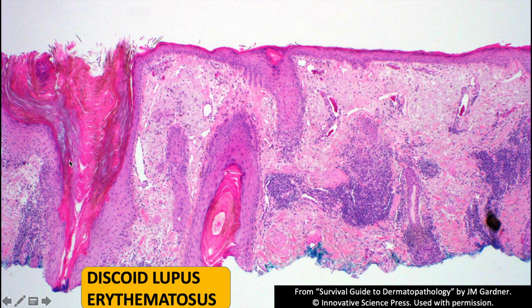When you get discoid lupus particularly, this can show up as kind of a solitary or kind of ring-like lesions on older sun-damaged skin, and it can look a lot clinically like an actinic keratosis or squamous cell carcinoma. And microscopically, because it's kind of chronic, the keratinocytes can look a little atypical. And sometimes there are AKs present in the background. So it's important to think about this.